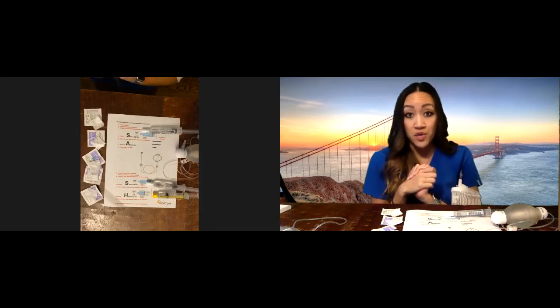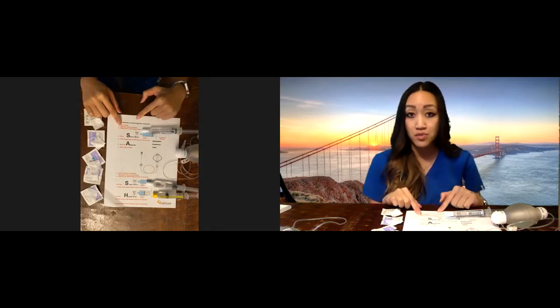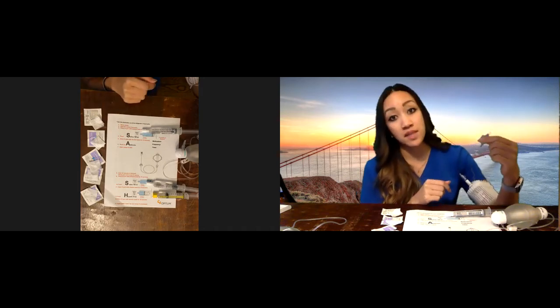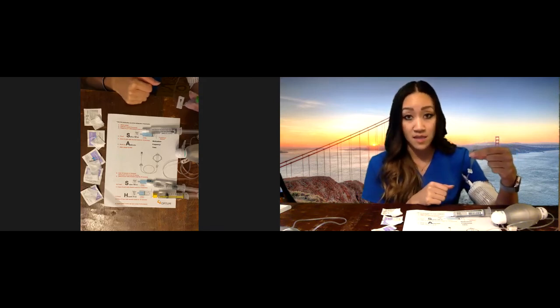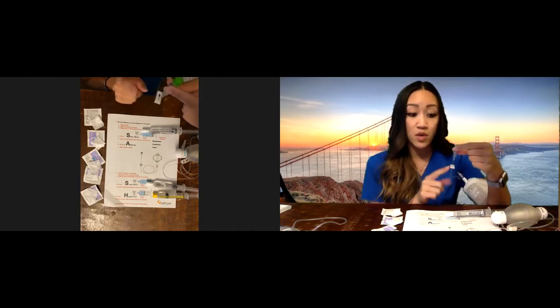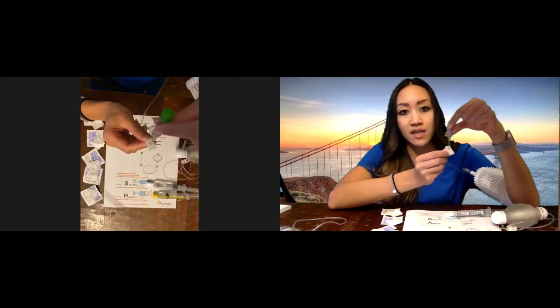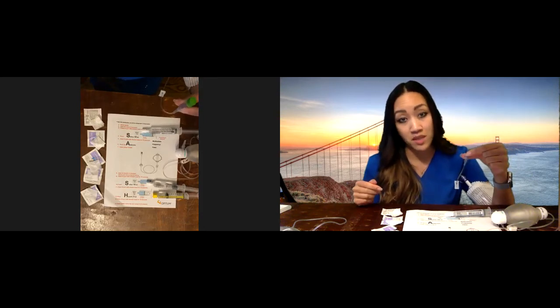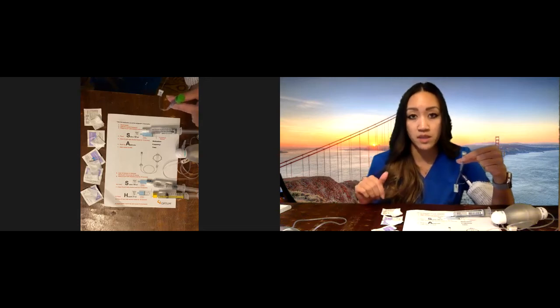Number one is to wash your hands, which we already did. Number two, open up the IV clamp if it's present. Some PICC lines and midlines will have a clamp — it depends on the hospital and the type of PICC line. If you see a clamp on your extension, go ahead and open it. All you do is slide the white clamp over to open. If you don't see a clamp on your PICC line or midline, don't worry about it.